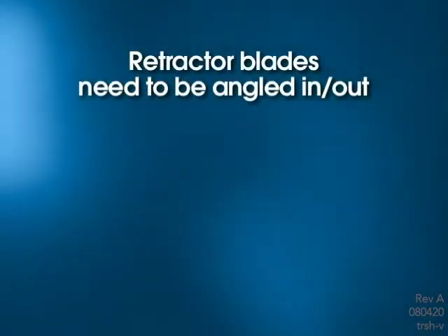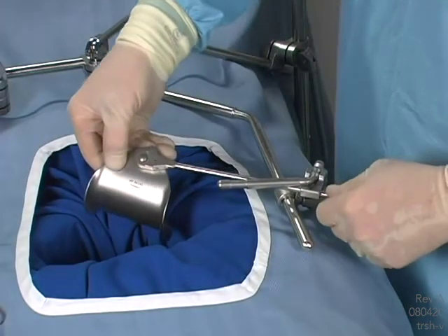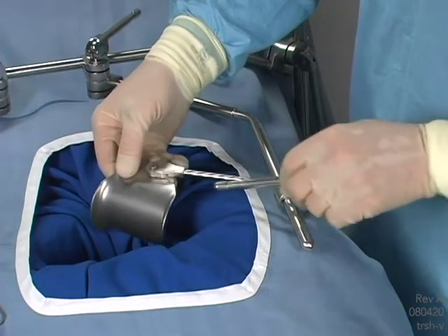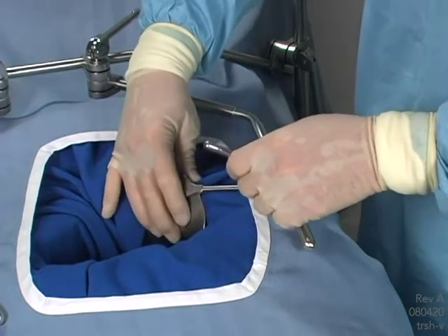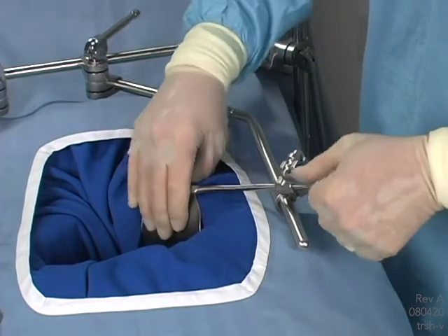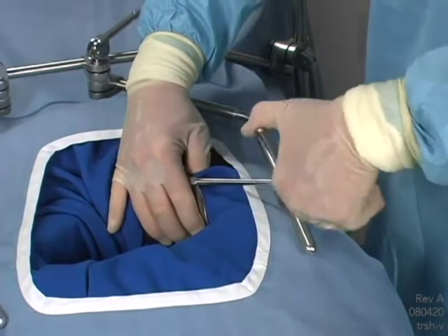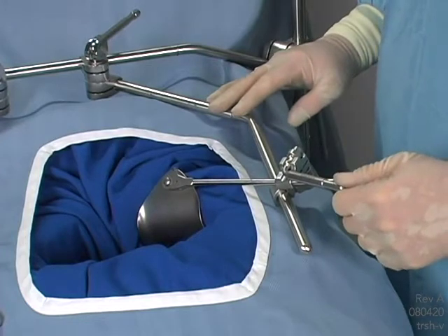Retractor blades need to be angled in or out. Sometimes it may be necessary to toe in, toe out, or angle a retractor blade. This can be accomplished two different ways. When using a CAM2 clip-on joint with handle, the blade handle may be swiveled and rotated off to the side. Once the retractor blade is positioned properly, it is locked in place. The Thompson is the only retractor system with cam joints strong enough to hold retractors in this fashion.